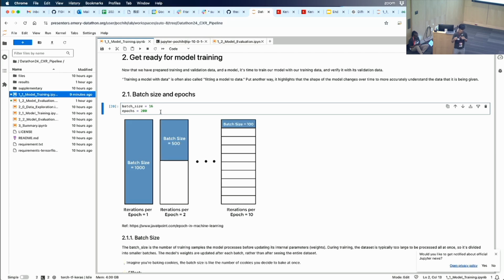Okay, but if I choose a smaller batch size, for example, if I calculate a loss for each image, then maybe I have to make my learning rate smaller because every step I'm not sure, since I just look at one image. So I will take a step and then the other image to take the other step. And in this case, my step will be smaller. My learning rate will be smaller.